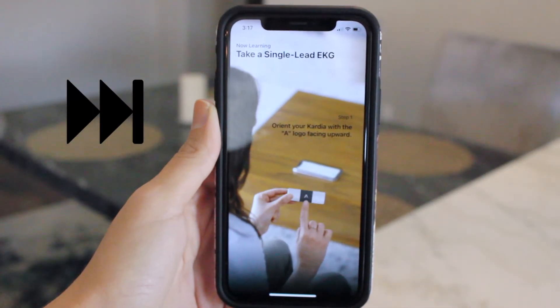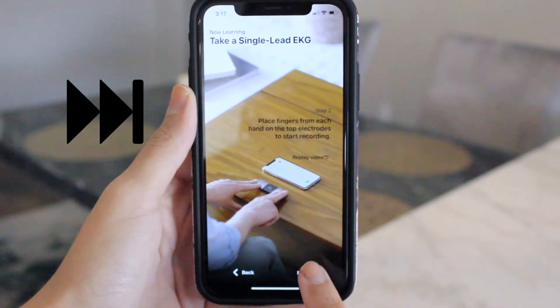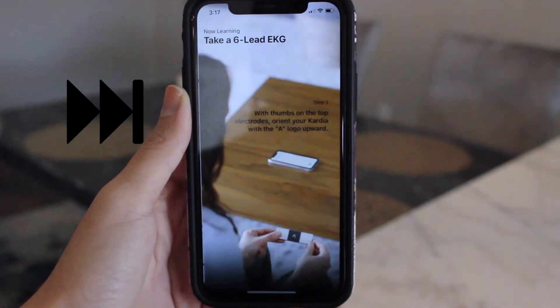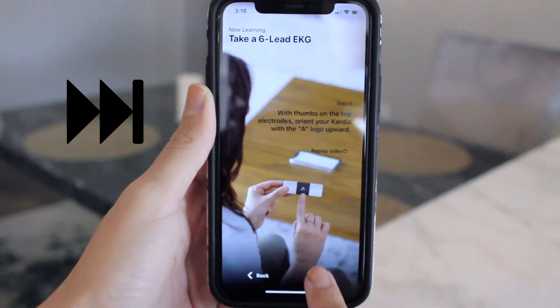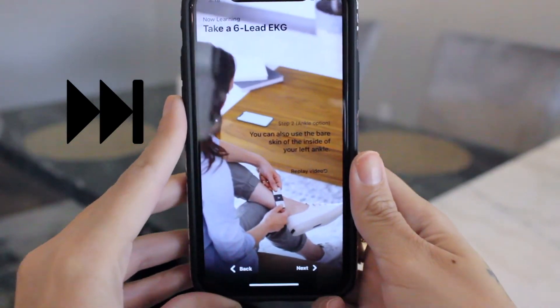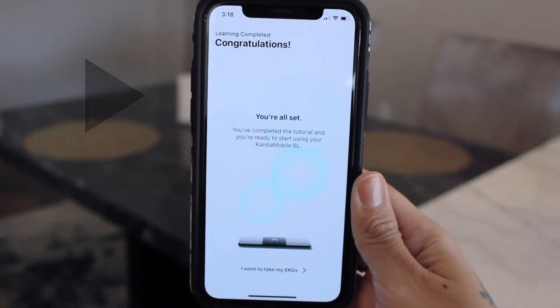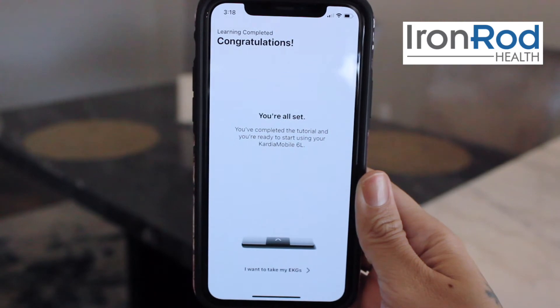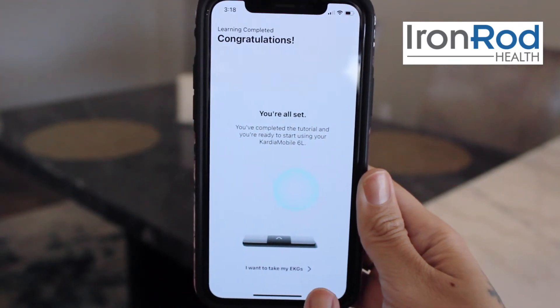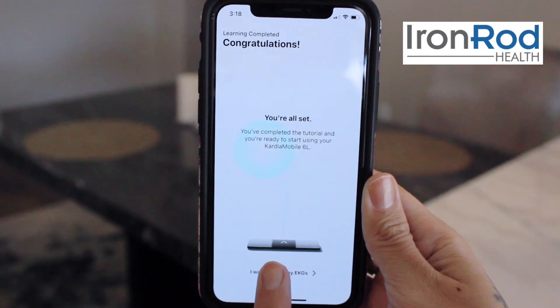The next few slides will go into further detail about how to properly take a reading. If you'd like more time to go through these, feel free to pause this video and resume it once you've reached the end and you see the page that says you're all set. Once you've reached this page, press I want to take my EKG at the bottom of the screen.